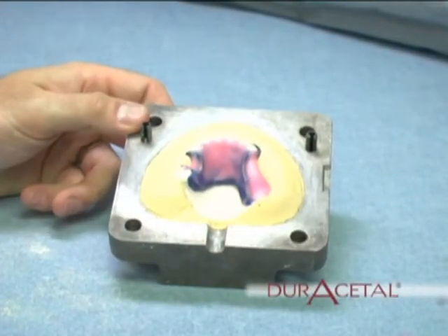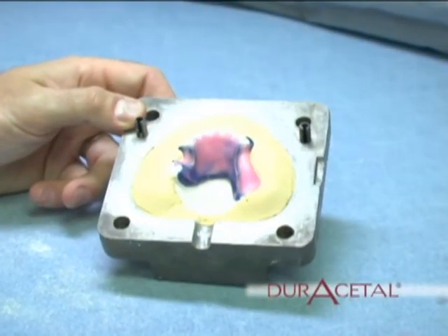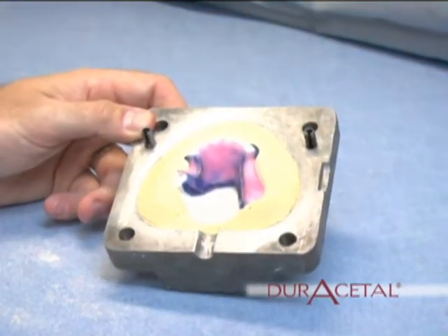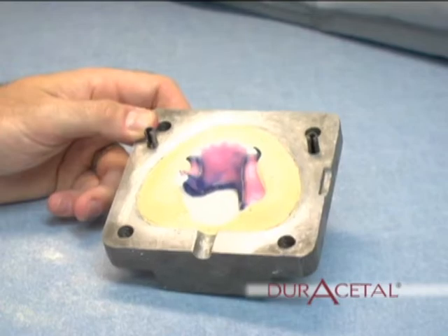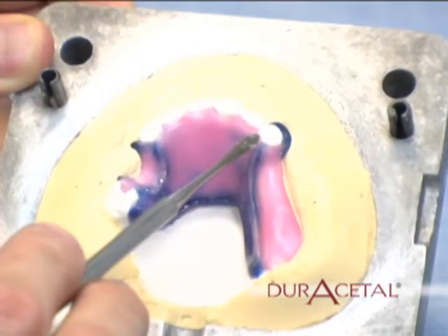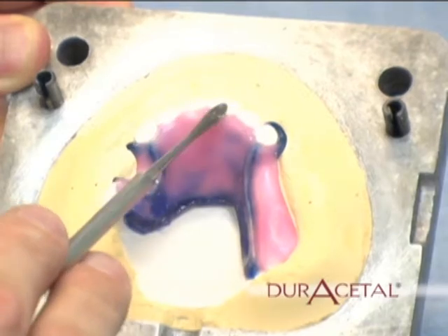Next, invest the wax case in the lower half of the flask using yellowstone. When the stone sets, grind off any areas that would be an undercut.